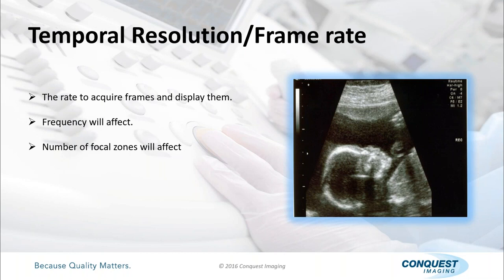Did they set an industry standard for those three rates? Is there an industry standard that would set those? Nope. I wish there were, but technology is becoming wonderful, right? In the old days, a probe may only go from 2 to 5 megahertz, and now they're going from 1 to 9 megahertz. So there really isn't a standard that would say exactly what they are.